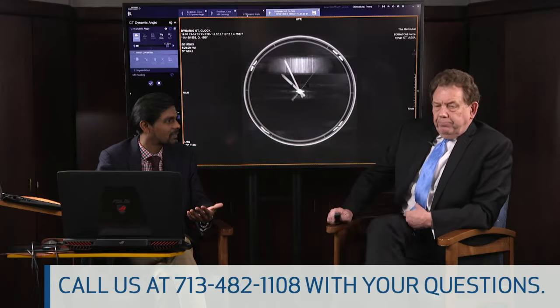One advantage here is that we are talking today in the context of endoleaks, but this imaging can be applied to any dynamic disease process, whether it is dissections or peripheral artery disease. So maybe there are much more clinical benefits there, but this is just a concept, a way to explain how we are able to use this technology. I love the clock. Okay, I thought this was a generic clock.